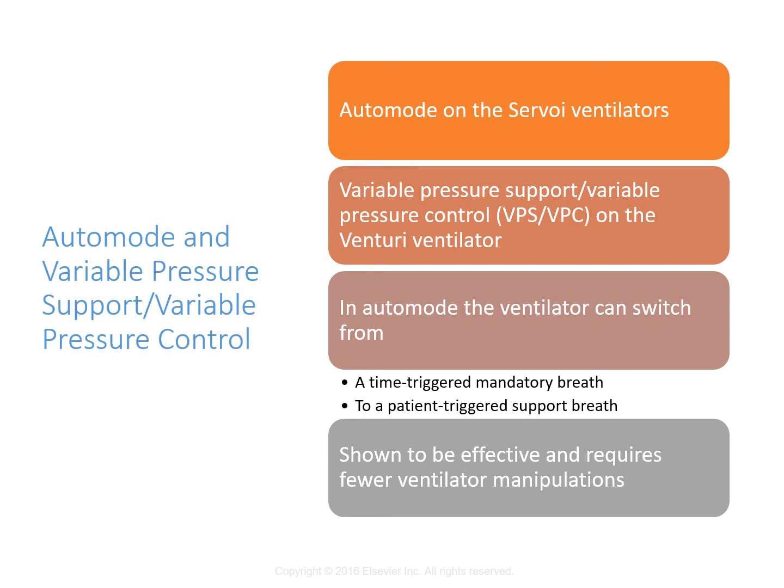So there are clinical studies that need to evaluate more completely how auto mode is effective as a weaning technique. So it needs some more support, but I do think it is a very advantageous mode for certain patients.